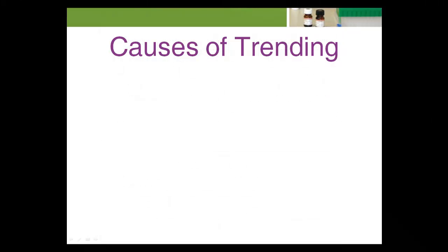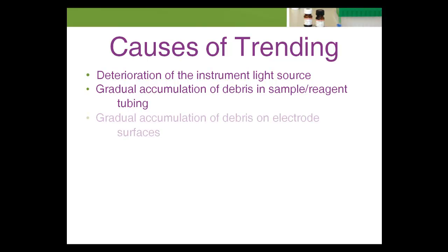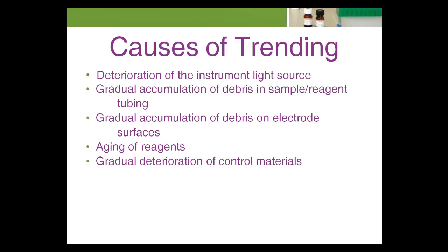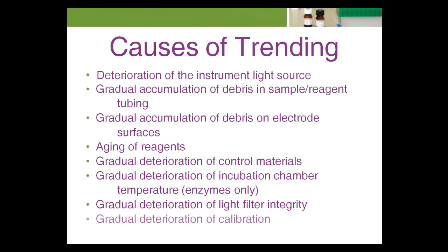A trend indicates a gradual loss of reliability in the test system. Trends are usually subtle. Causes of trends may include deterioration of the instrument light source, gradual accumulation of debris in sample or reagent tubing, gradual accumulation of debris on electrode surfaces, aging of reagents, gradual deterioration of control materials, gradual deterioration of incubation chamber temperature (enzymes only), gradual deterioration of light filter integrity, and gradual deterioration of calibration.